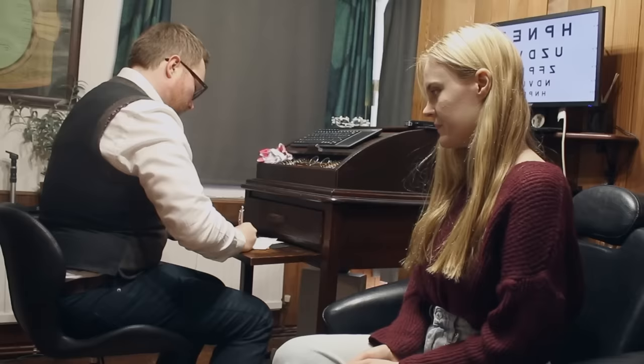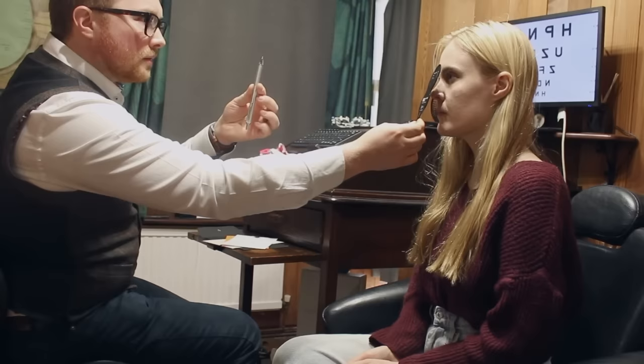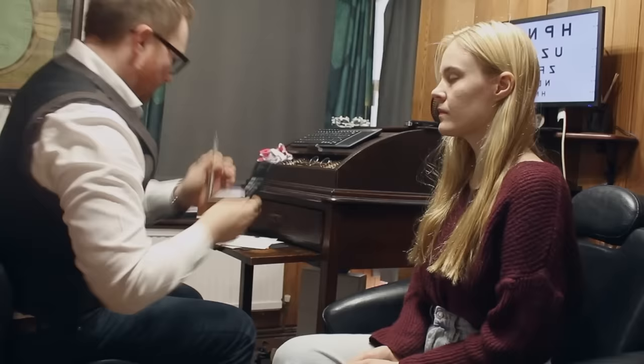Perfect, that's good. And we're going to do the same, but this time I'm going to get you to have a look at the tip of my pen for me. Brilliant. So it's basically telling us how your eyes sort of talk to each other and focus on a single point, looking to see how the eye muscles are working. They're all looking absolutely fine there.